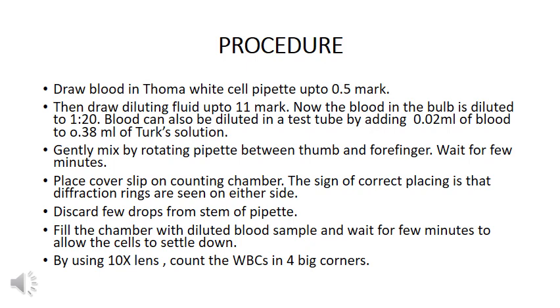I am going to repeat it: we will dilute blood, 0.02 milliliter, with 0.38 milliliter of Turk solution. Then we will find that it is actually a 1:20 dilution.